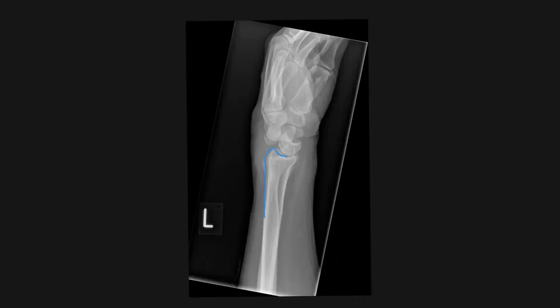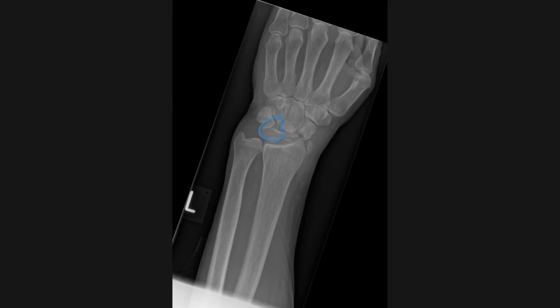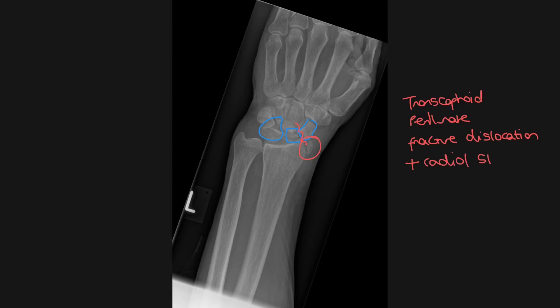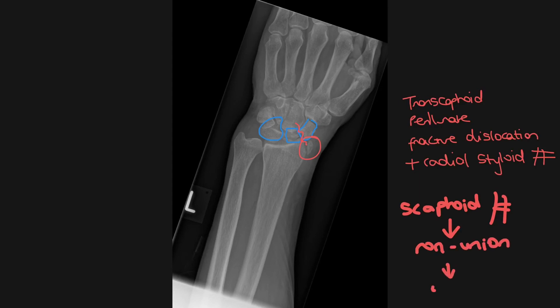In this next example the distal radius lines up again with the lunate and the capitate is out of line, again in keeping with a perilunate dislocation. However when we look at the PA film we can see additional injuries: there is a fracture through the waist of the scaphoid and also a fracture through the radial styloid. Fractures of the scaphoid are very important to pick up because they are the most common carpal bone fracture, and also because of their distal blood supply they're prone to non-union and therefore prone to AVN, as is seen in this x-ray.